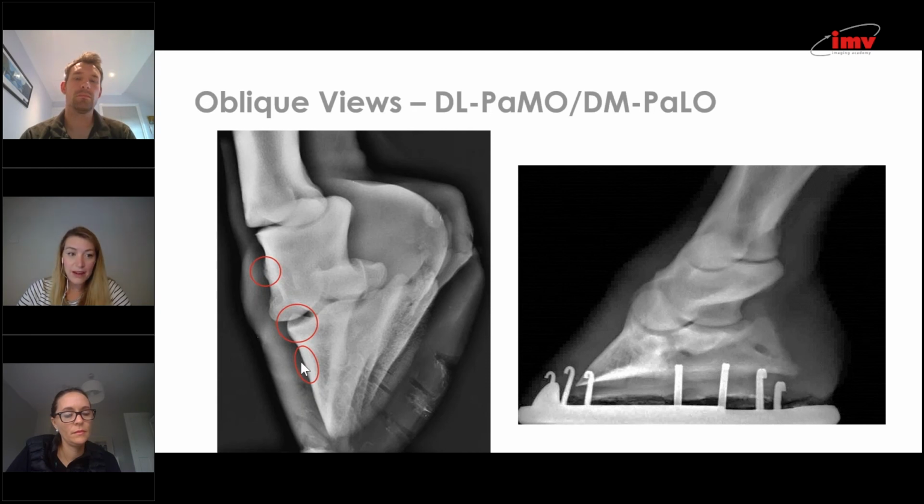So you'll often find horses with laminar pathology that perhaps may or may not have had subtle radiographic signs. There's this region on the dorsal medial and dorsolateral aspects where there tends to be the greatest reaction of the laminae. So I think it's an important site to evaluate, especially since atypical or subclinical laminitis is something we underdiagnose quite a lot in sports and leisure horses.